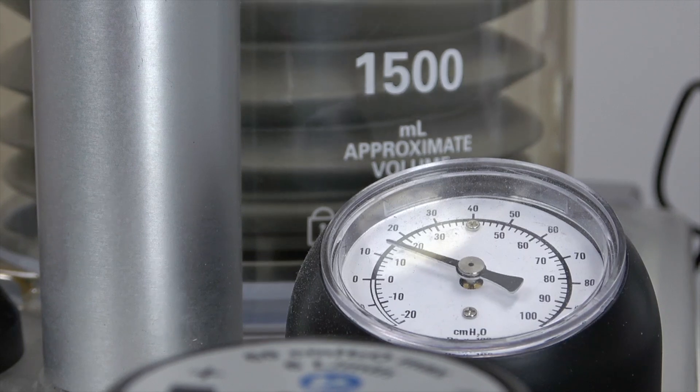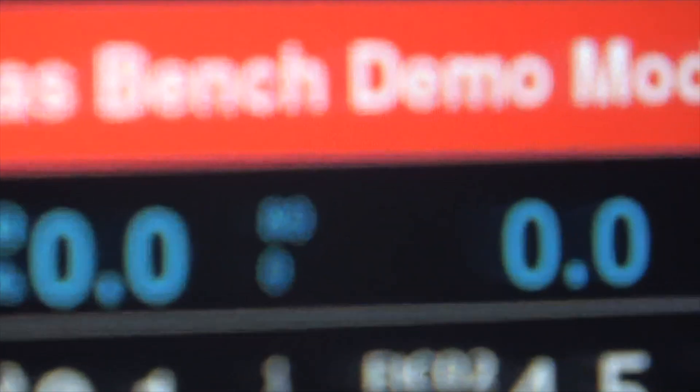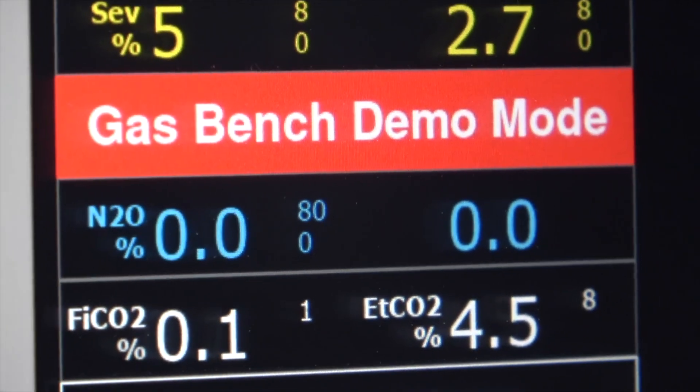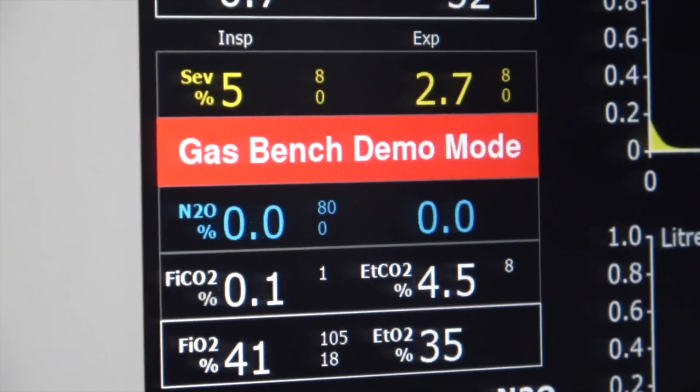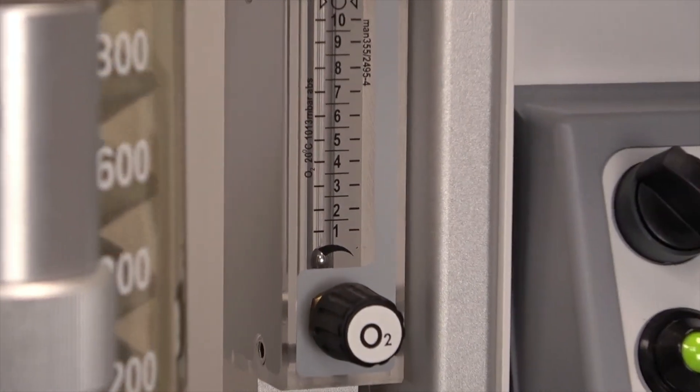This Prima 460 anaesthetic machine can deliver low-flow and minimal-flow anaesthesia and has CE, FDA, and many standard and country approvals for adult, paediatric, and neonatal use. The Prima 460 is also available with an optional oxygen therapy flow meter.